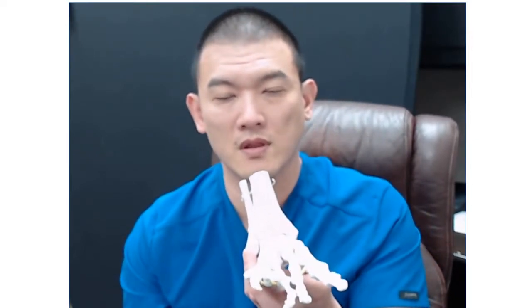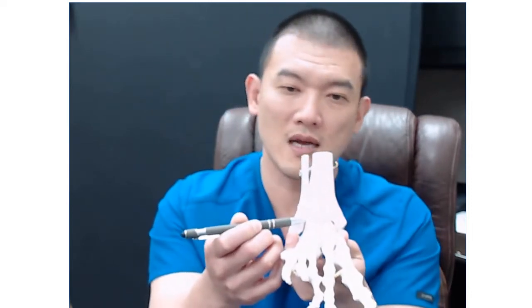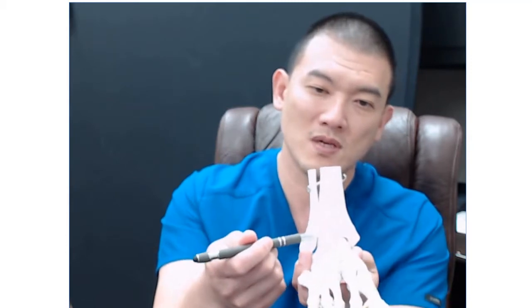Hopefully you enjoyed the video. You'll see a lot of tissue here, but mainly we're going to see a lot of inflamed tissue right in this area. That's what we're going to be looking at — it's called anterolateral impingement syndrome. You can have it on this side — anteromedial. This is the medial side, which is the tibia. Anteromedial and anterolateral impingement syndrome — we can have it on both sides. Ankle arthritis treatment with ankle arthroscopy.